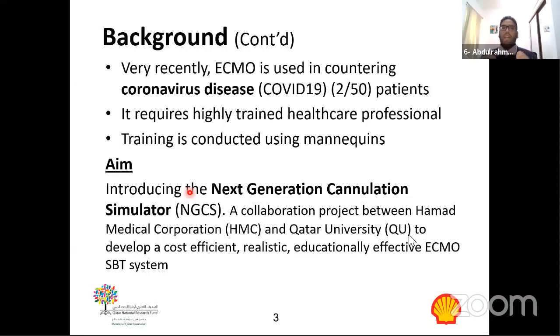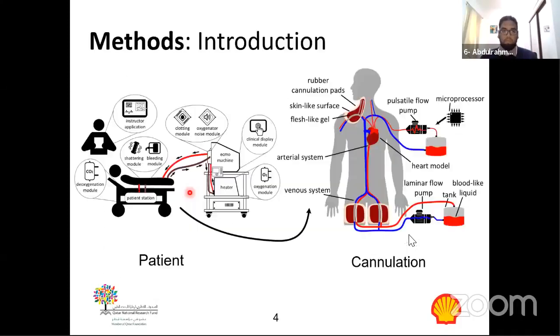So here, our aim is to create the next generation cannulation simulator, which is a collaborative project between Qatar University and HMC, in order to develop and emphasize these 4 points: cost efficient, realistic, and educationally effective ECMO SBT system, but not just a cannulation simulator, the whole system.